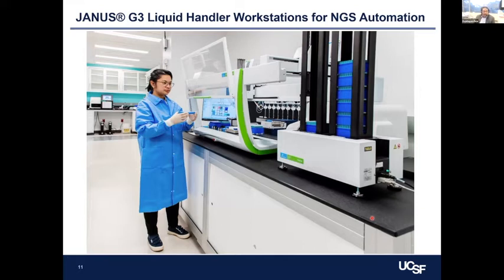The long-term goal, it's not even long-term, maybe in 6 months, we are hoping to run every single DNA that comes into our lab for either bone marrow or solid organ transplant on one platform. So that's the next generation sequencing. Making one flow HLA typing is very cost effective, because it's less technology and less time involved. You buy reagent from one company at mass level, then you can save a lot of money. So we're hoping to implement it in 6 months.